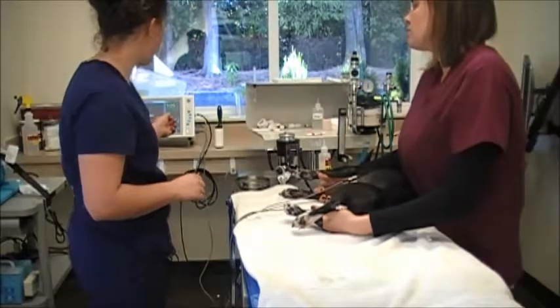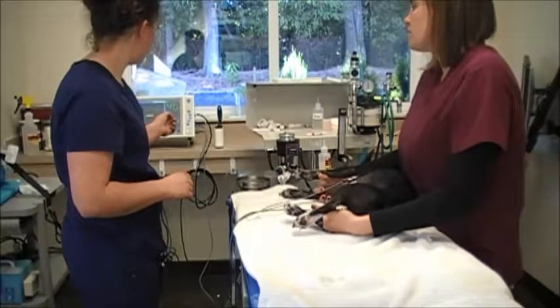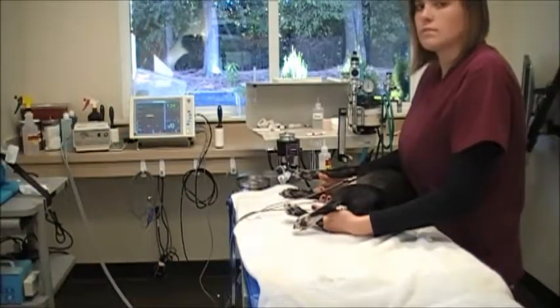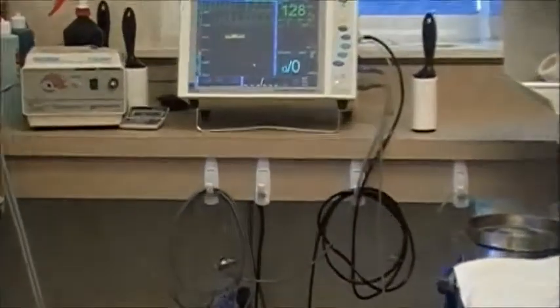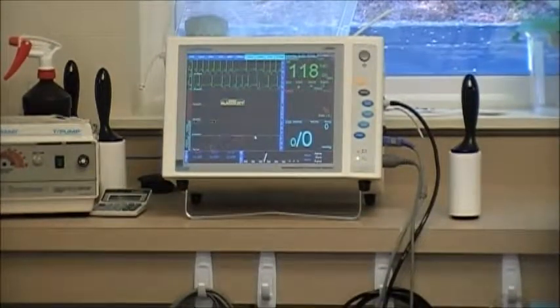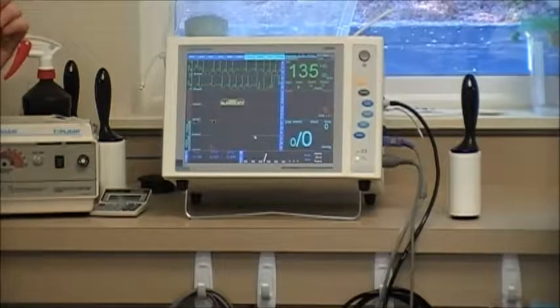I'll give these a minute to register on my machine. And we were right on the left leg. So that's showing up on my monitor and giving me an accurate representation of the electrical waves in the heart.